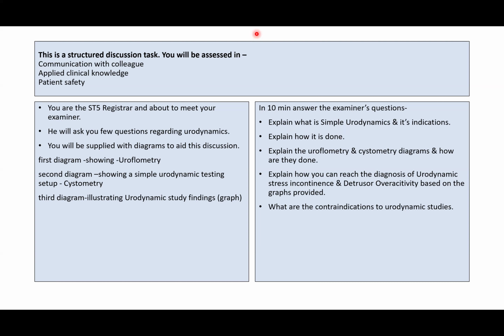Simple urodynamics is usually used to see any problem in the lower urinary tract function.